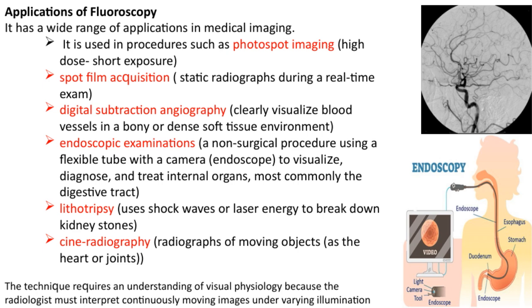These are non-surgical procedures using a flexible tube with a tiny camera at the end, called an endoscope, allowing us to visualize, diagnose, and sometimes treat internal organs, most often in the digestive tract. Another important use is lithotripsy, where shock waves or laser energy are used to break down kidney stones non-invasively, providing relief without surgery. And we also have cineradiography, which involves capturing radiographs of moving objects like the heart or joints, giving us dynamic insights into how these structures function.